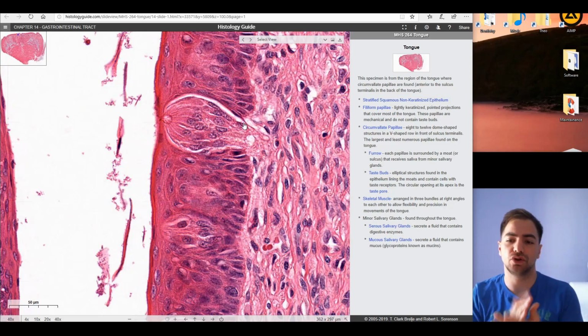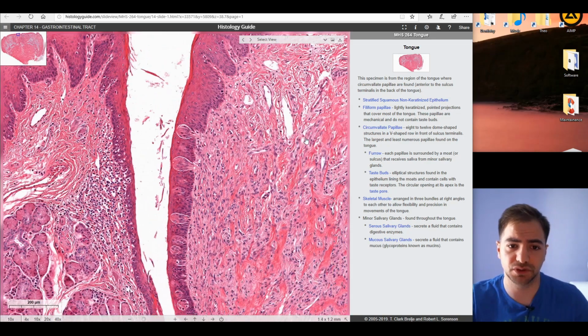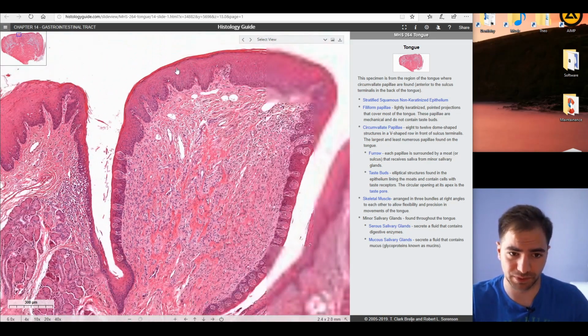Always, always, always a basal cell has a common function of regeneration and reparation when it comes to this specific structure. For example, here the basal cells are also progenitor cells of the taste bud cells, of the taste receptors. So this is again the typical appearance of the circumvallate papillae.